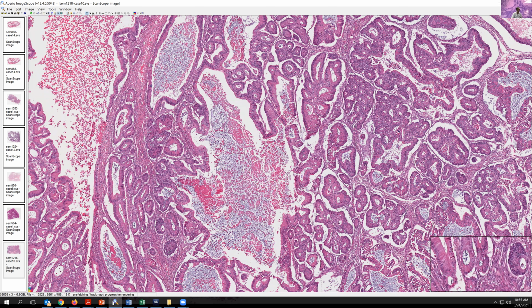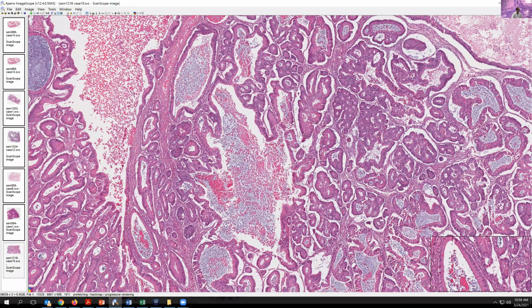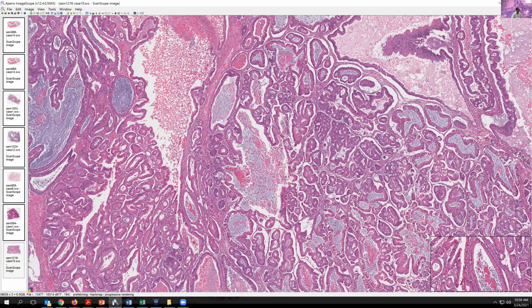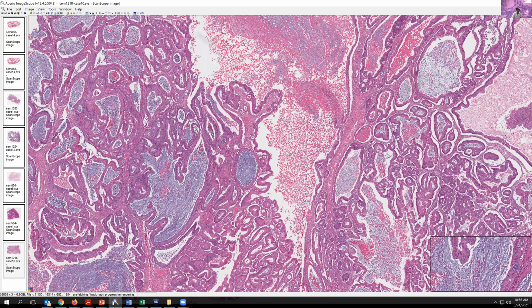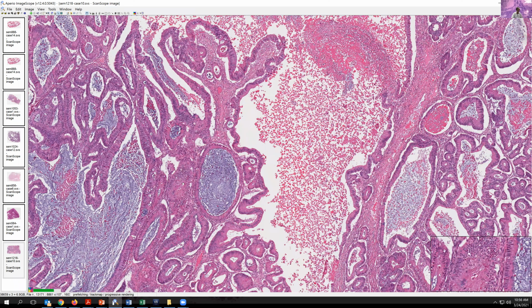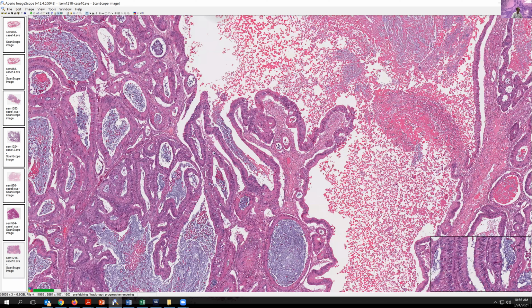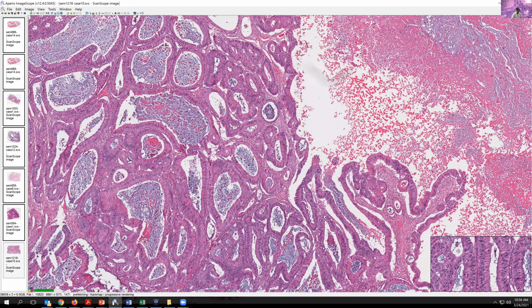Now, what ovarian tumors might this be mimicking? Well, some endometrioid tumors can have a very mucinous appearance, with large dilated glandular structures. And so differentiating this from an endometrioid tumor would be very important, and especially important to do at the time of frozen section because those are going to be worked up and staged quite differently. So what features can help you? Well, the dirty necrosis is more characteristic of colonic carcinomas.